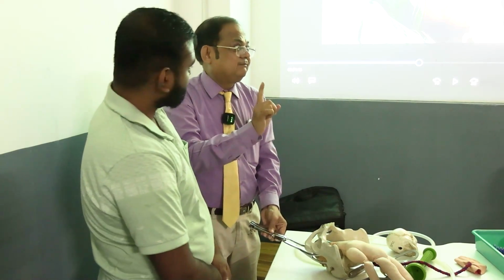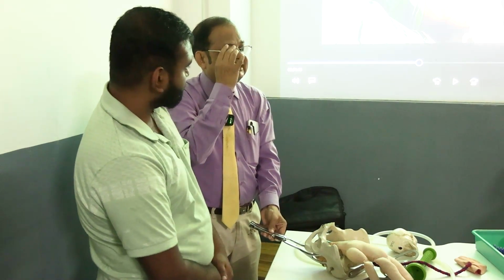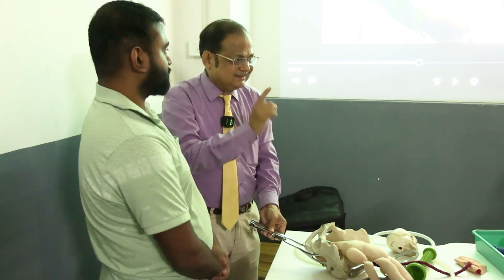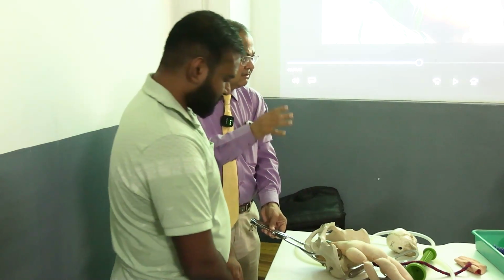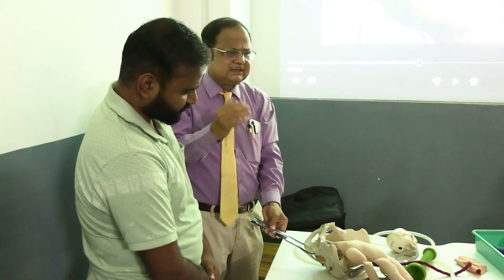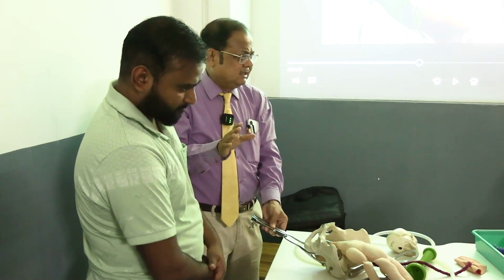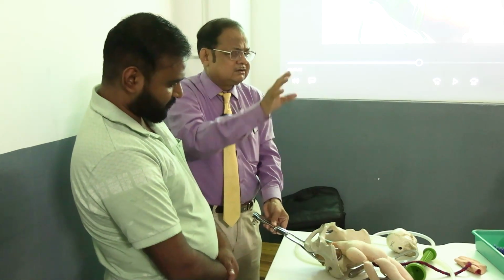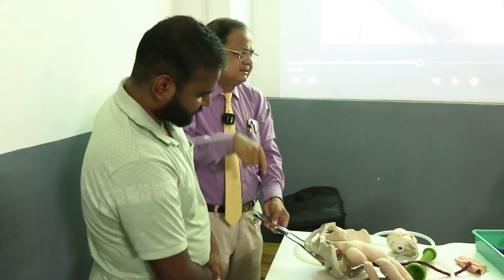If you cannot apply, if you think there is some misjudgment, some problem, you cannot diagnose. Particularly in case of excessive caput, that is a pathological caput formation, and excessive molding, we cannot always identify the suture lines.